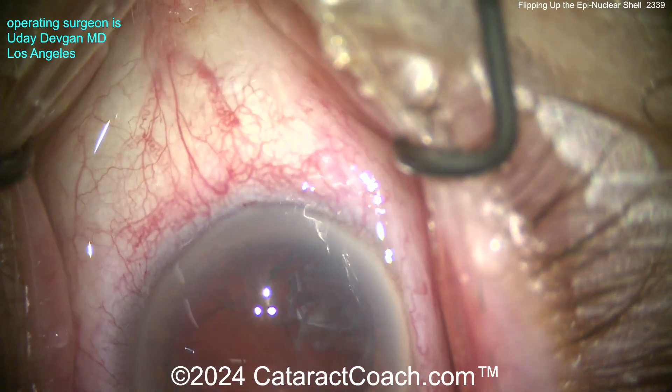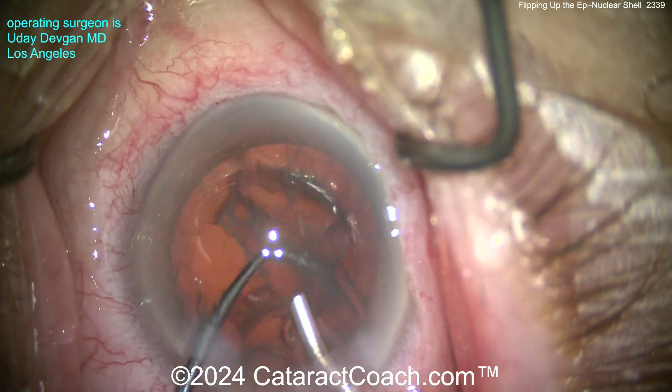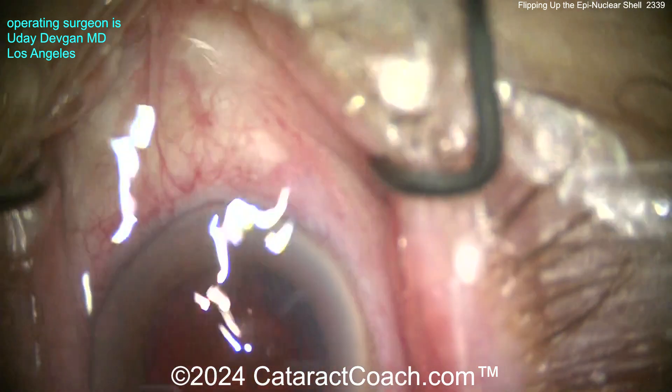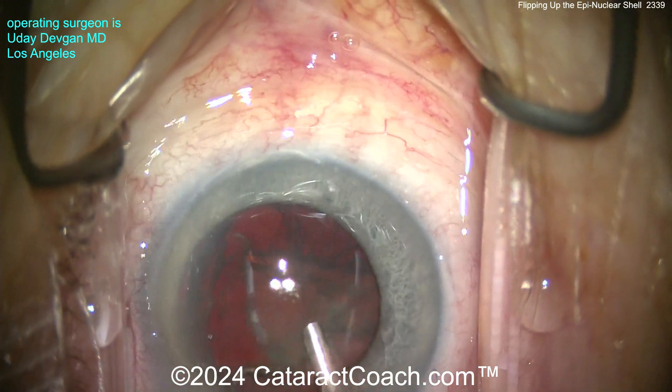Cleaning up the capsular bag is pretty easy this way. It's a lot more efficient to clean up the epinuclear shell with the phaco probe than with the I/A probe. The I/A probe works too, but it's just a lot slower and less efficient. Let's look at that first case one more time — grabbing here, and then using the chopper to flip it up.